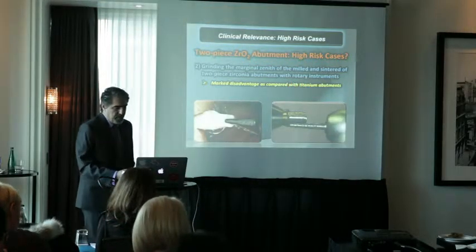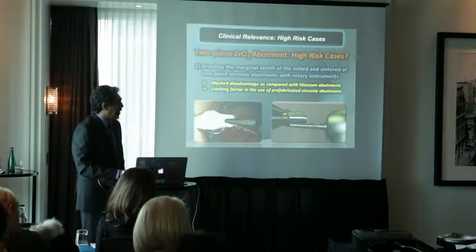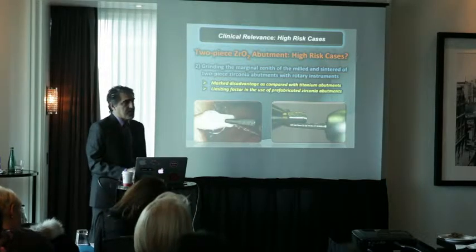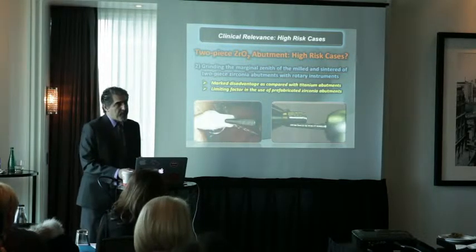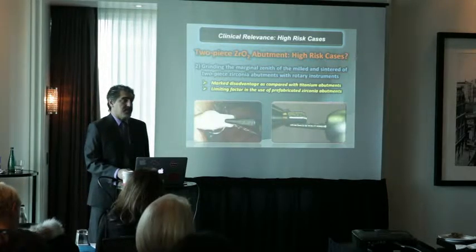With the zirconia, you are going to have a problem, mostly because, of course, the stress concentration area is going to be there, and of course, we are going to take away some bulk of the zirconia. For that reason, prefabricated zirconia, at one time they were very popular, and almost all of them broke. Prefabricated zirconia abutments are completely useless.